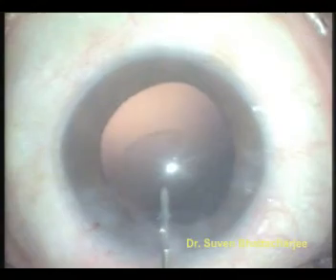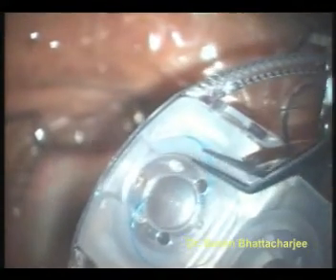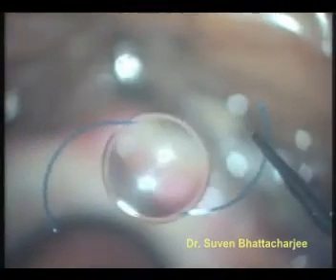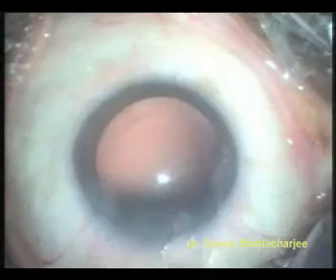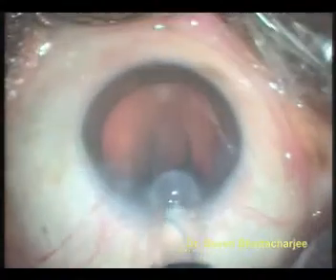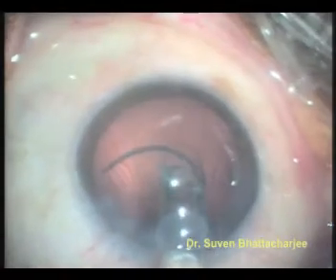The capsular bag is inflated with viscoelastic jelly. This is a three-piece hydrophobic acrylic foldable IOL with a central 6 mm optic and two limbs called the haptics. The IOL is removed from its casing and placed inside a cartridge. The wings of the cartridge are folded to fold the IOL. The cartridge is inserted into an injector which has a rod advanced to deliver the IOL into the eye.